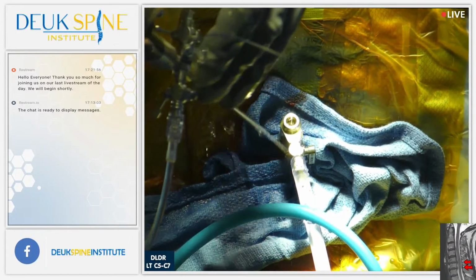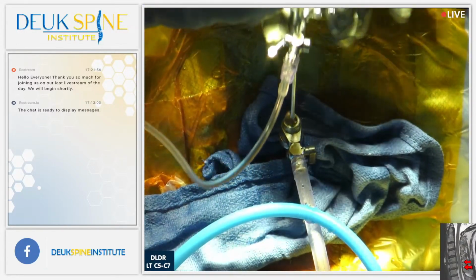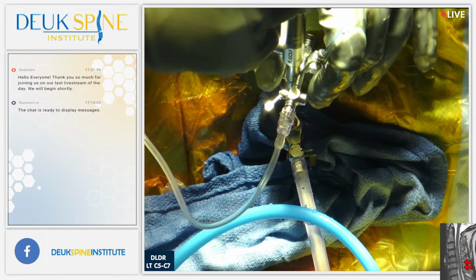What is it? You want to buy some? Oh, I need a. No. That one here, the correct one. You want to take her to the laser? I need that, there we go. You want to take care of the laser, please?